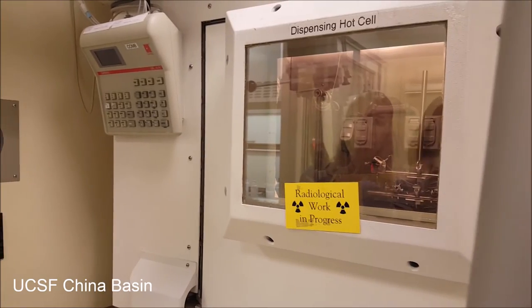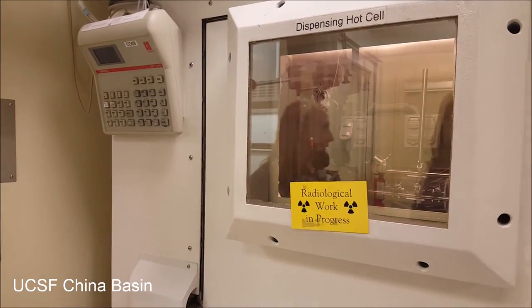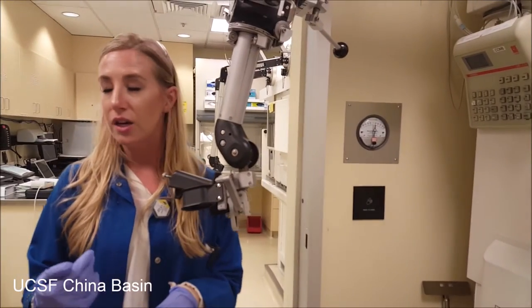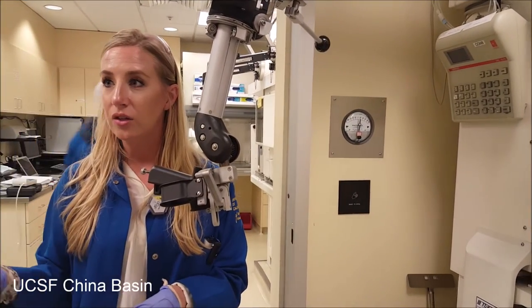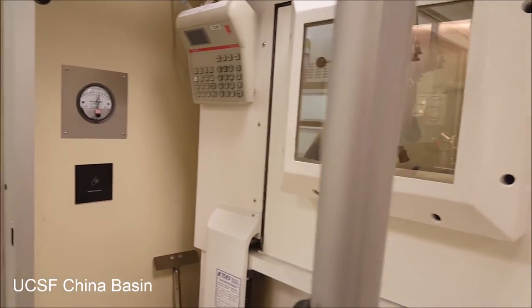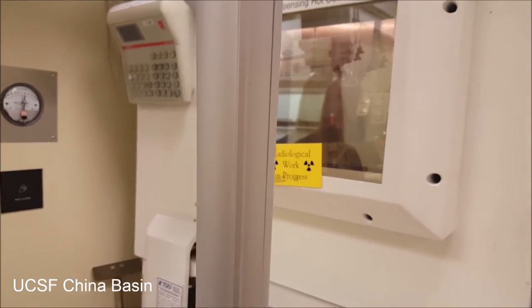So then we have a nice, pretty product. It's about 16 mLs of product, and depending on how long the cyclotron ran, we might have a lot of activity in that 16 mLs, or we might have a little bit, just based on how much activity we needed for the day.